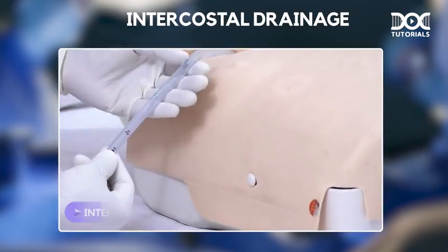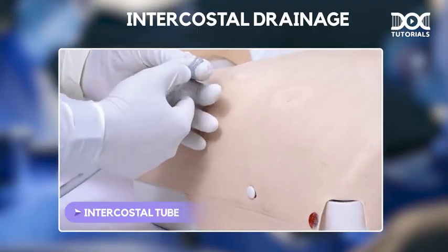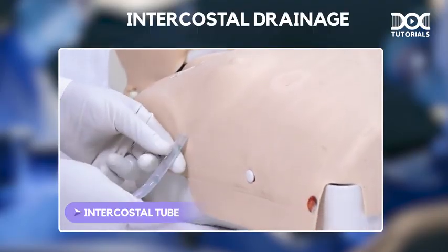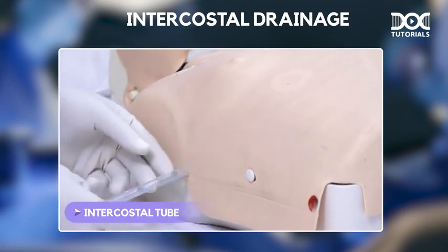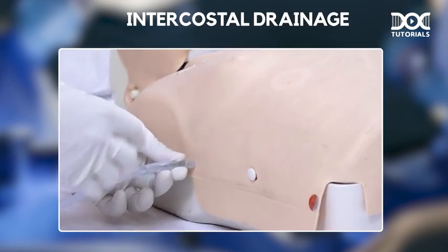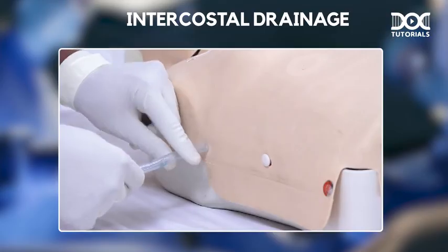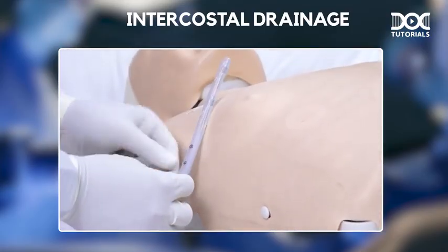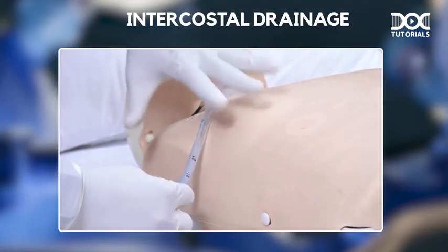You can see this is an intercostal tube having markings. There are holes in the tube, multiple holes. So I have to pass this tube inside. At the level of the mid-axillary line, at the fifth intercostal space, I am passing this tube. So this tube should be pushed. All the holes should be inside the pleural cavity.